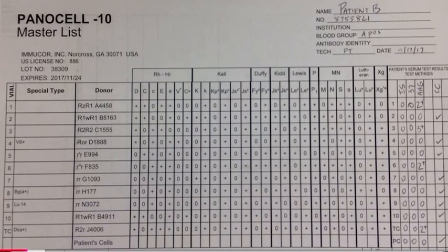Okay, so the first thing I like to do, as usual, is just have a look generally at what's going on here. So the first thing is we'll look at the patient cells or the auto control, and we can see here we have 0, 0, 0 at initial spin, 37 degrees, and the AHG, otherwise known as the anti-human globulin phase. And then the last one is the check. That's the check cells telling us that the AHG test was carried out correctly.